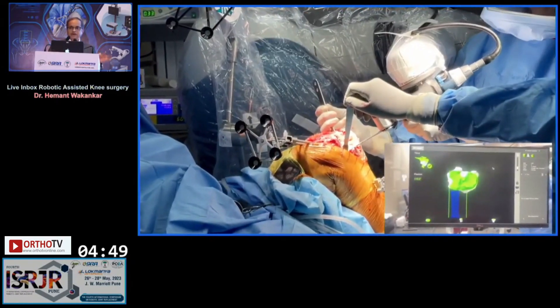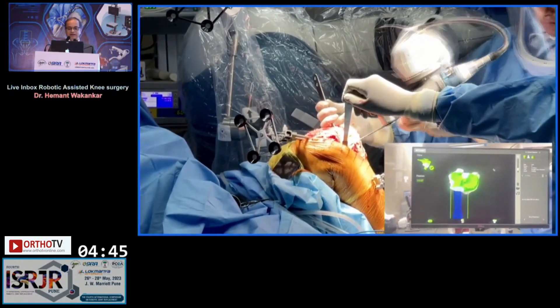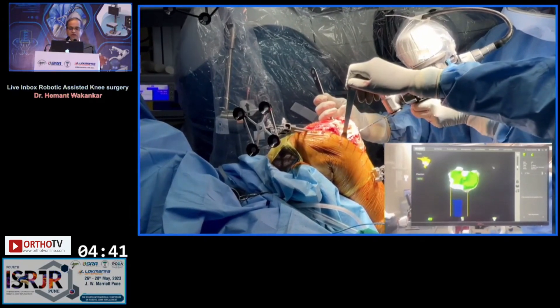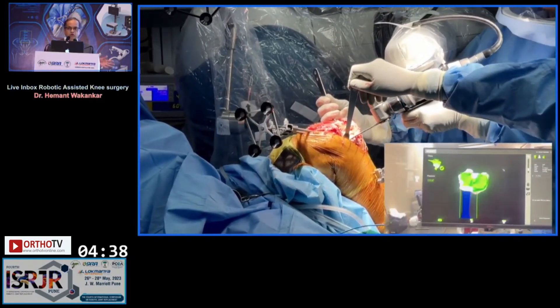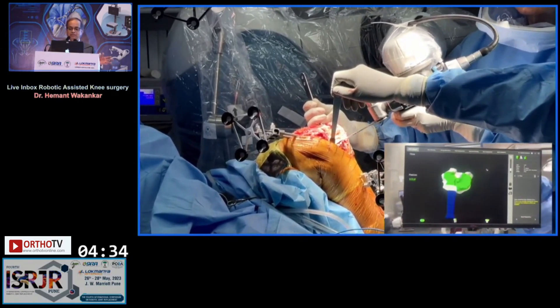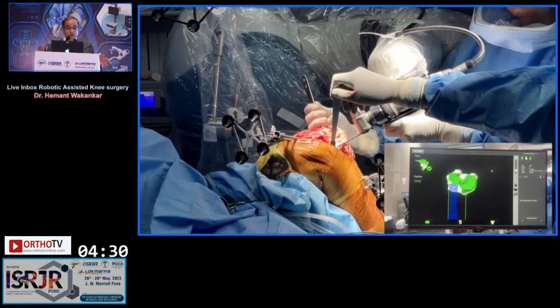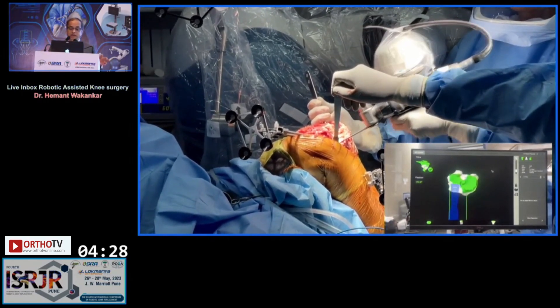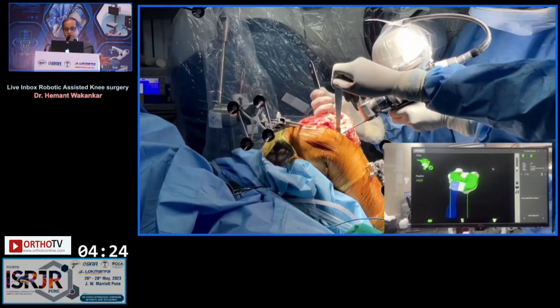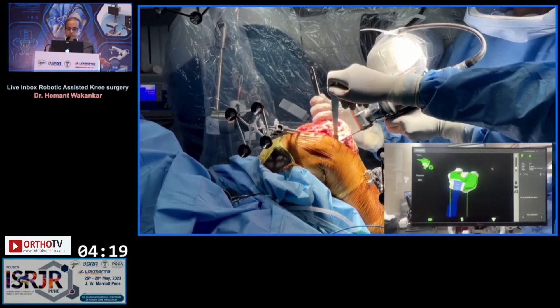The saw actually stops if I try to push it beyond the haptic boundaries. Next is the tibial cut. I'm putting the spike there, but the majority of the time I don't need it because the saw will stop if I try to push it beyond the haptic boundaries. I have to obviously make sure that my saw does not go into the patella tendon, and that if I cut obliquely I should not be transecting the patella tendon. That care one has to take.